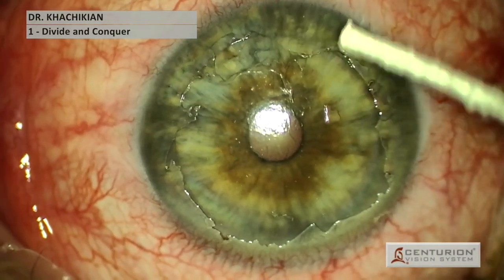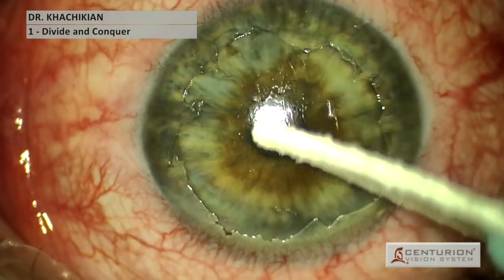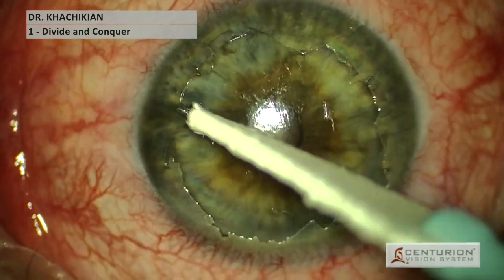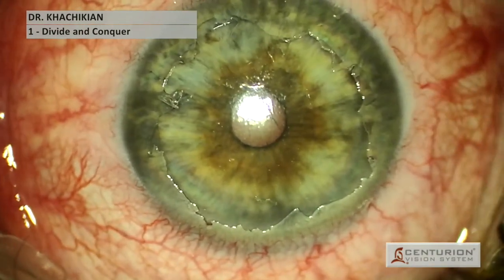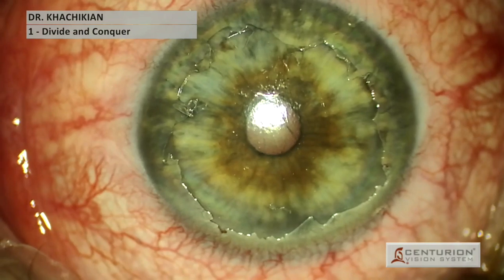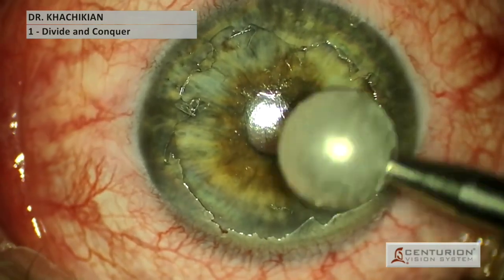Instead, a scratch is created. One of the treatments can be long-term contact lens use, maybe up to a month or so. But if patients have failed that treatment, the next option involves either diamond burr polishing or laser. Here we're using diamond burr polishing.